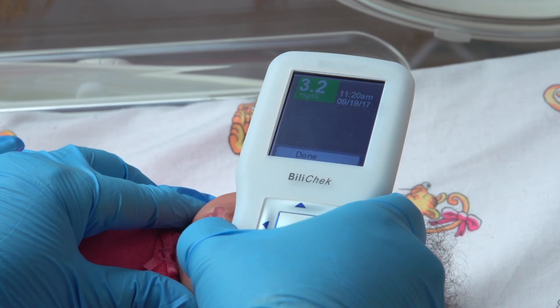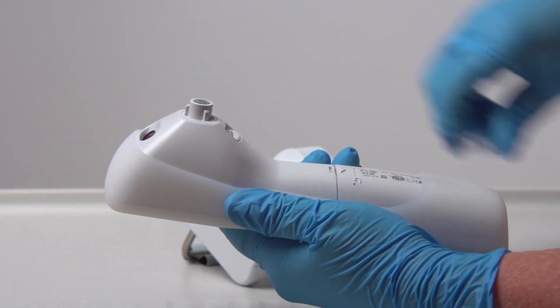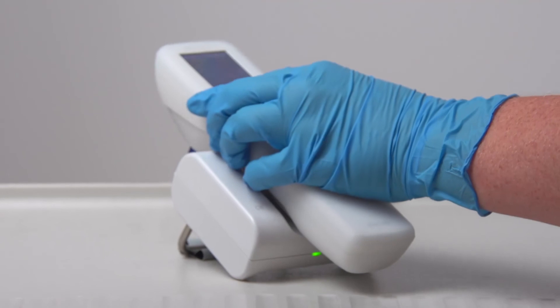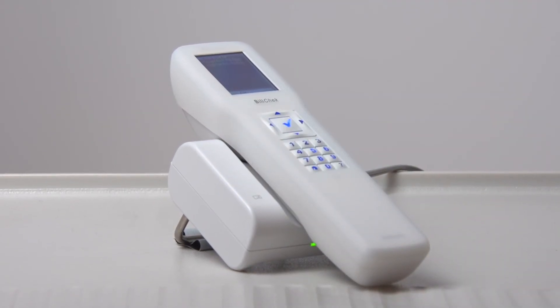When the readings are complete, the BiliChek device displays and saves all entered information. Remove and dispose of the BiliCal tip and apply the protective blue plug, then return the handheld unit to the charger base. If your device is configured to transmit data to a lab information system or electronic medical record system, when the handheld unit is returned to the charger base, all records since the last data transmission will be sent.